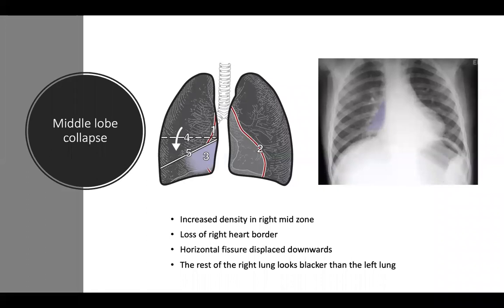That was an example of middle lobe atelectasis or middle lobe collapse. Features include increased density in the right mid-zone, loss of the right heart border, horizontal fissure displaced downwards, and the rest of the right lung appearing blacker than the left. The diagram shows: one — right heart border, two — left heart border, three — increased density in the right mid-zone, four — normal horizontal fissure position, five — horizontal fissure displaced downwards. The x-ray shows the collapsed middle lobe in purple.